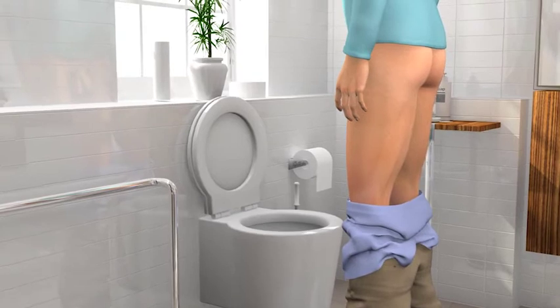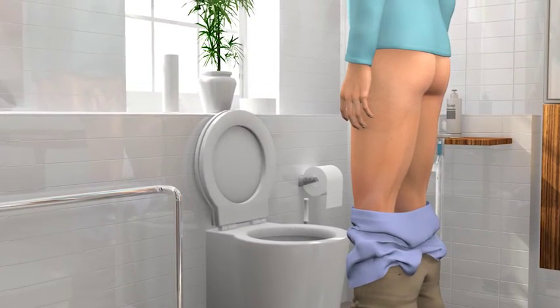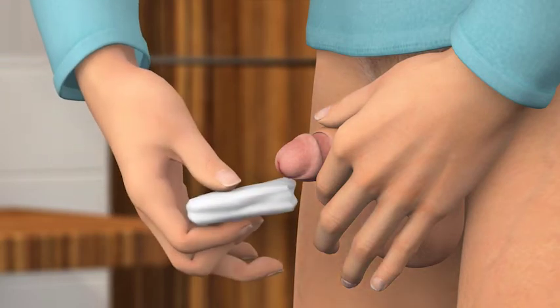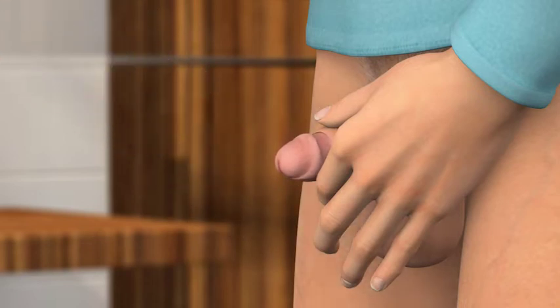To prevent pushing bacteria into the urethra and bladder when you use the catheter, you must first clean the head of your penis properly. Gently pull the foreskin back and wash the head of the penis. To remove any bacteria that might be present at the opening of the urethra, you should wash in a circular motion, starting at the urethra and working outward. Use each wipe only once.